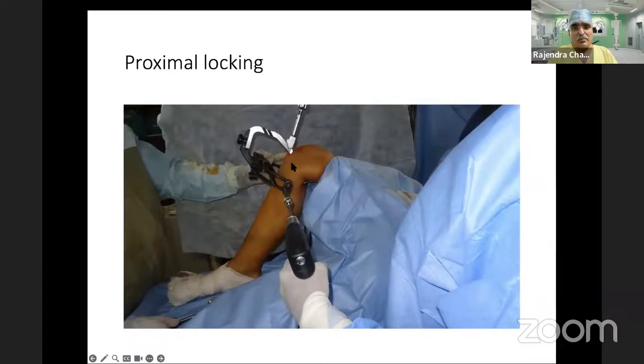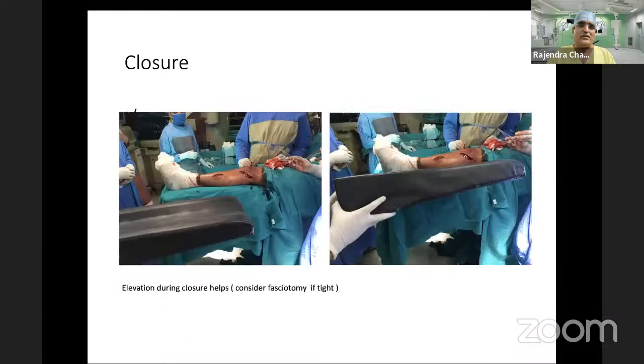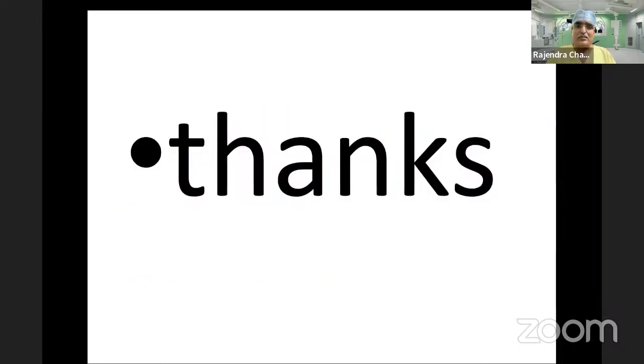May put two Steinmann pins so that the fragment is well coapted. And closure can also be done on a mini stand. And while closing, if the tibia is developing swelling, I like to elevate it on a sort of triangle so that the swelling is minimized. This is what I wanted to present about the poller screws.